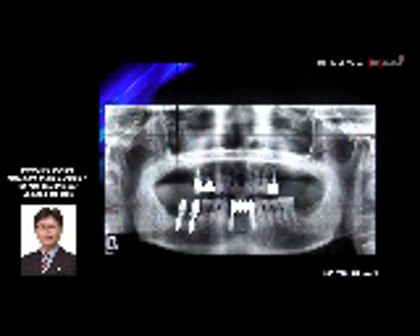If you want to connect for immediate loading, I recommend the ISQ number is 75 in the mandible, and the anterior is 70. Two months later, I changed the temporary crown to the final crown — the final restoration.